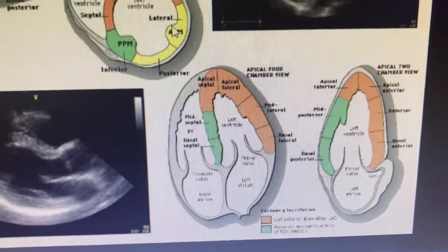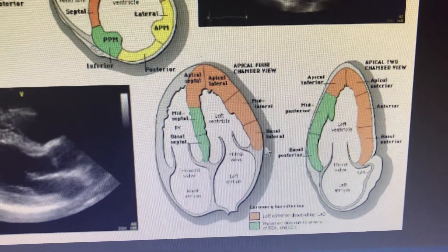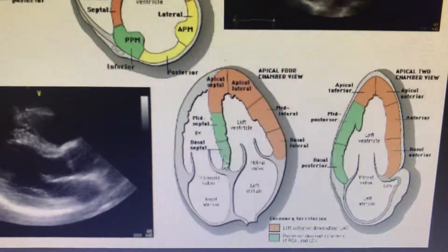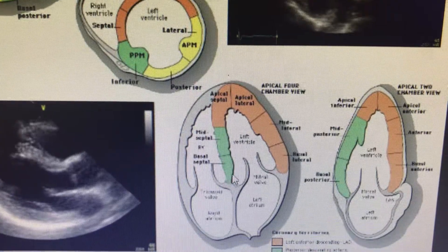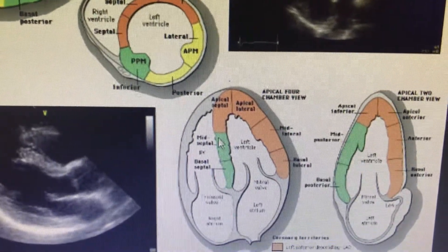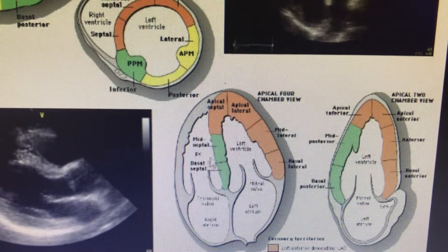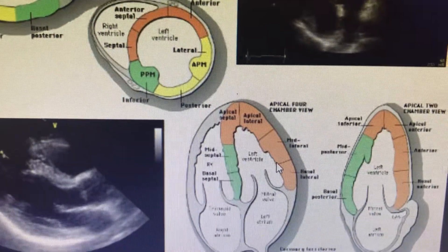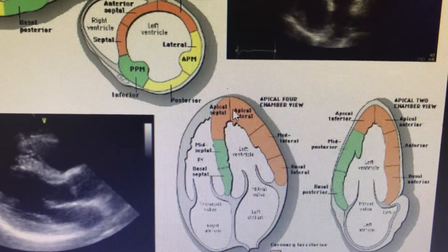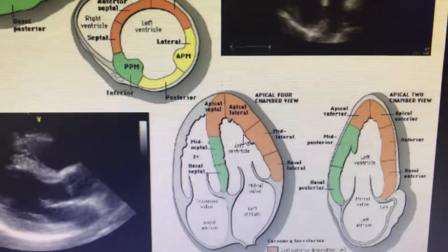Similarly, you go to the apical 4-chamber view. As I mentioned, it focuses mainly on the lateral and the septal view. The septal, mid-septal, and the basal septal are usually supplied by the PDA. And the apical chamber — all of the distal to mid septum and the lateral wall, apical lateral wall — are supplied by the LAD territory.